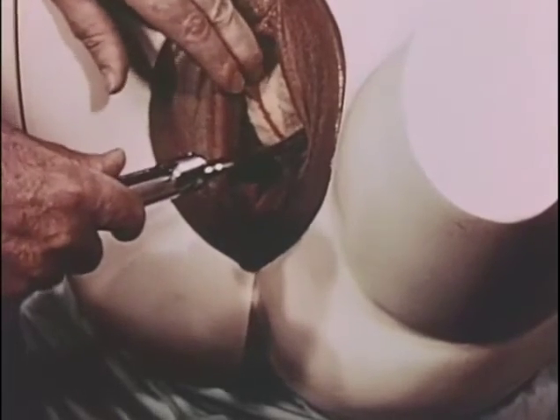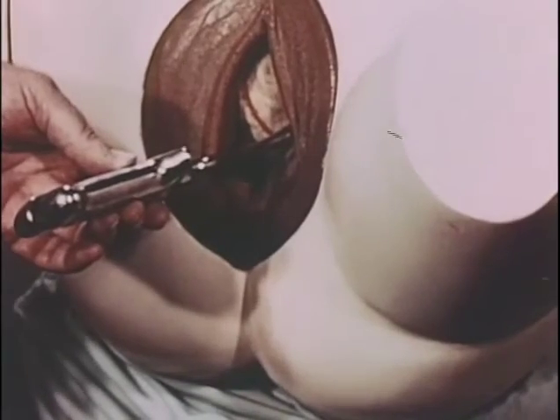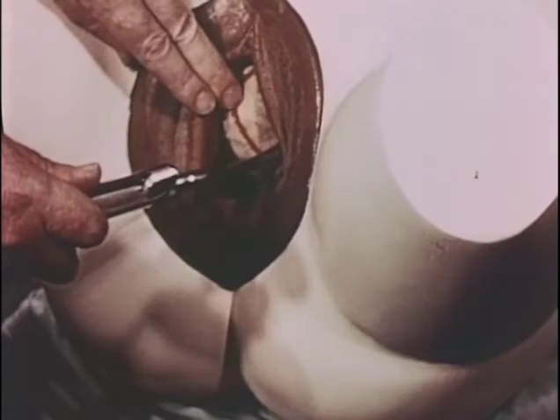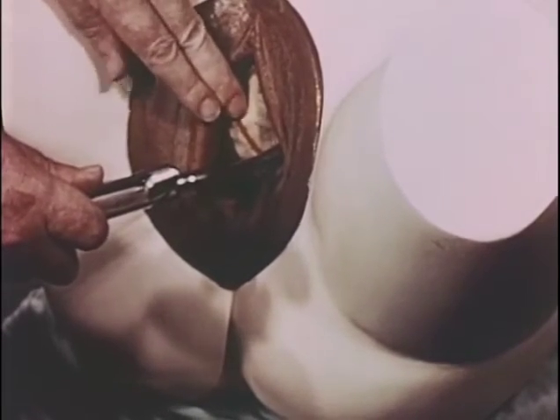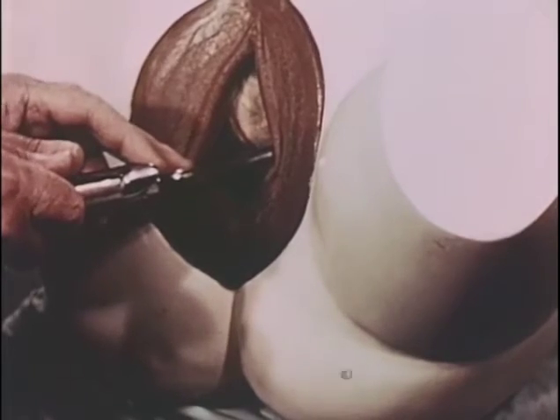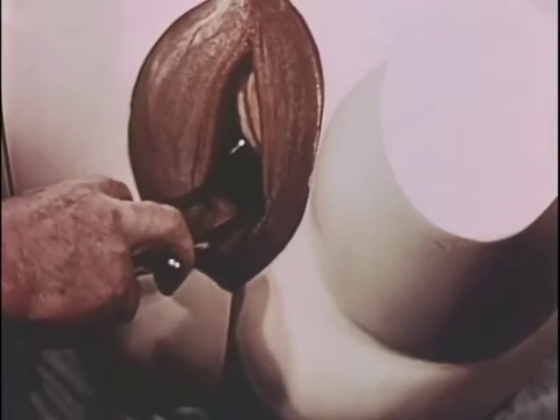And as is often the case in the right side position, there are some corrections to be made. Here we see that the posterior fontanelle is more than a finger's breadth above the plane of the shanks. Fenestrations can barely be felt. The sagittal suture is perpendicular throughout its length to the plane of the shanks. Now, it's best, before making corrections, to complete rotation to anterior. Compression of the handle, rotation with depression.